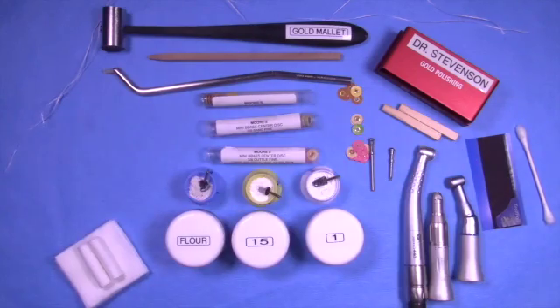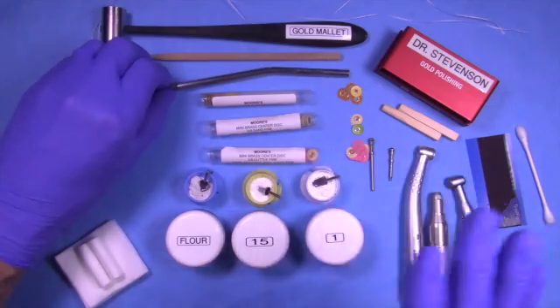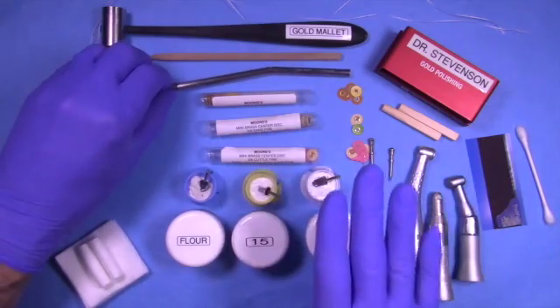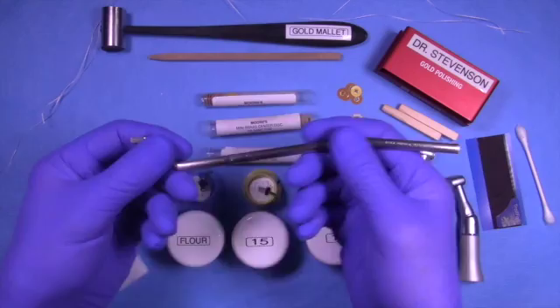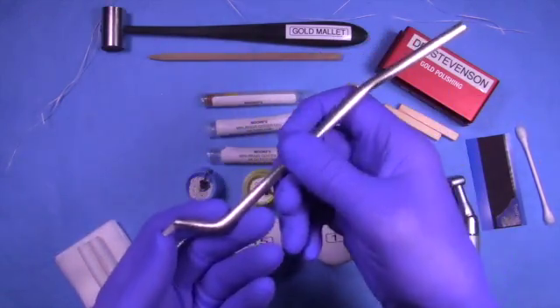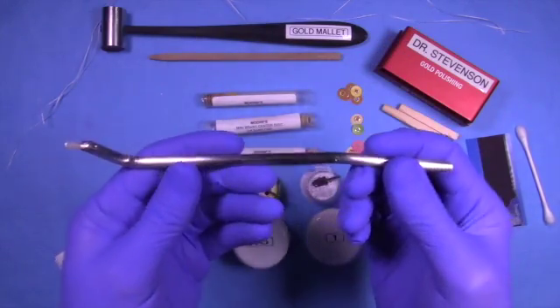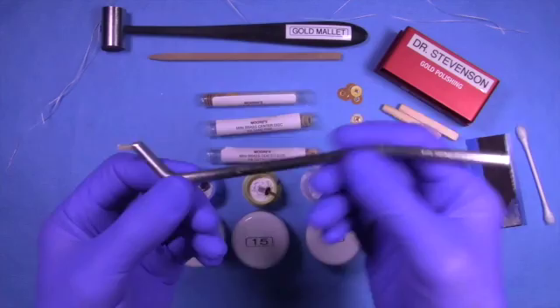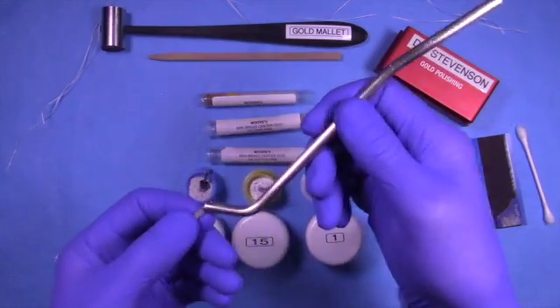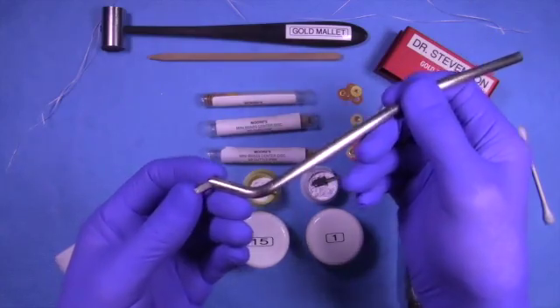The next thing I want to draw your attention to is this metal object here in the back. This is a cementation device that you place on the inlay or onlay, and then you mallet on the opposite side.